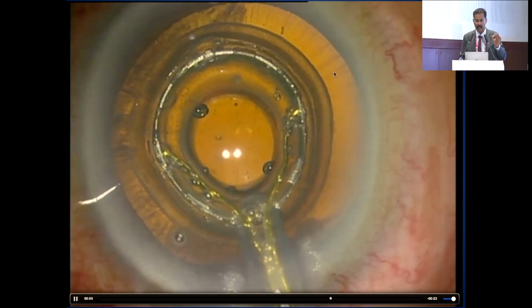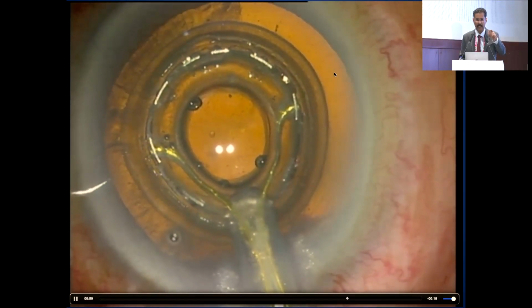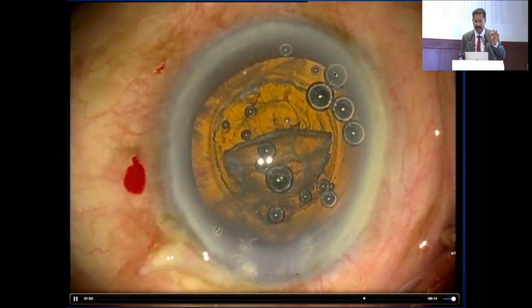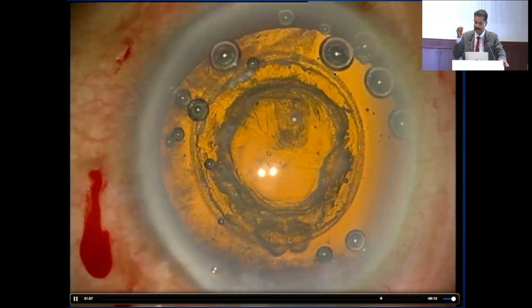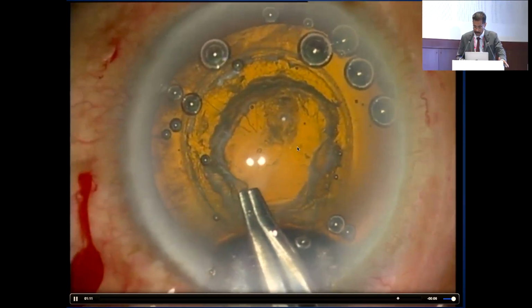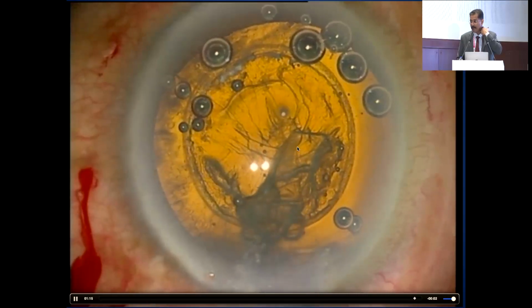See the lines? Then the energy is delivered, and it is so quick, and it is one shot. It makes a complete rhexis with the electrical pulses, low energy, fast electrical DC current which is passed through, and you get a complete rhexis here. And it is simple, easy, and it is cheaper than your femto. But I don't know, somehow it has lost its fancy.